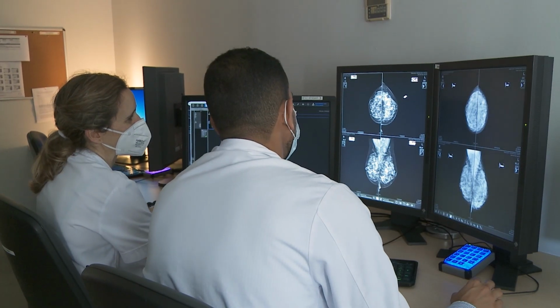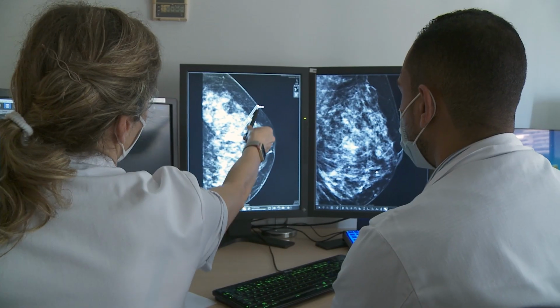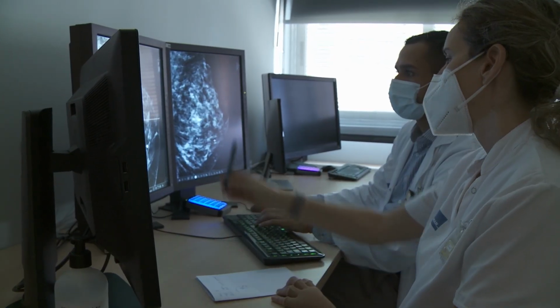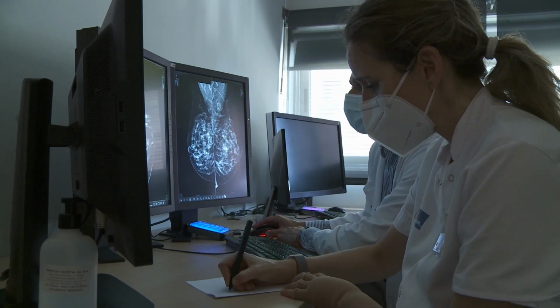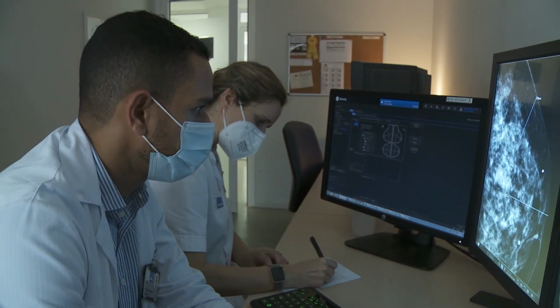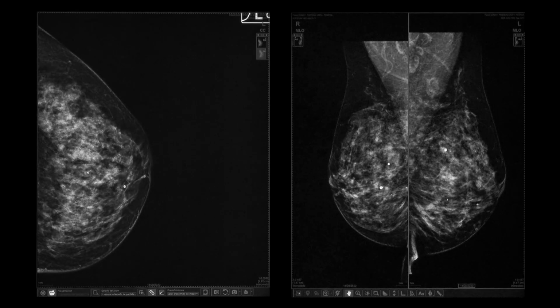When performing a biopsy, it's essential that both the radiologist and radiographer carefully review the case together in advance. There is also a golden rule: try to use the projection which gives the best view of the lesion. Likewise, use the access route with the shortest distance from the skin, making it as comfortable as possible for the patient. This will facilitate targeting, optimize timing, and therefore increase success rates.